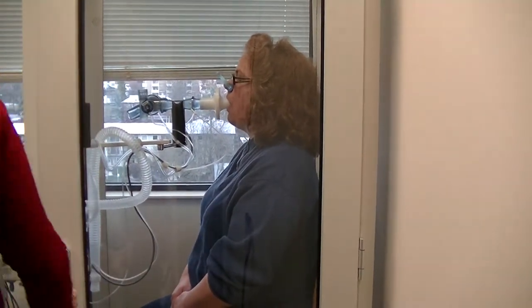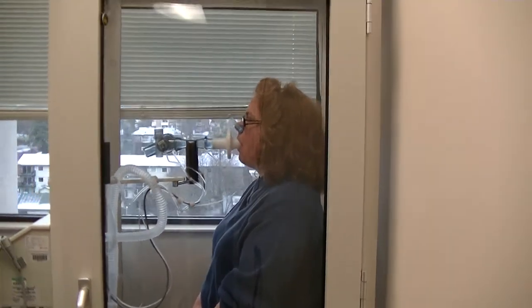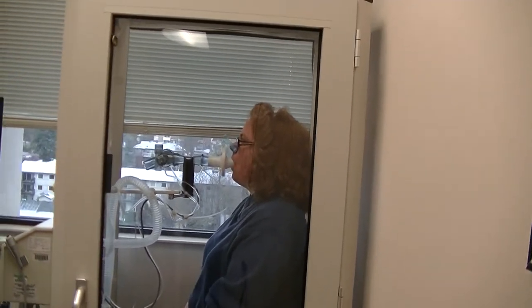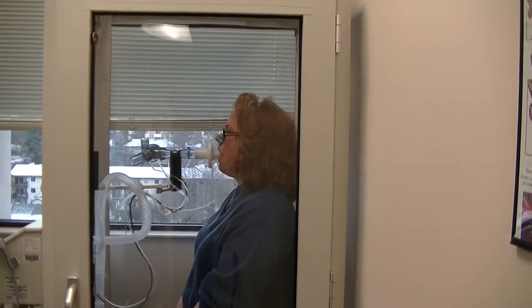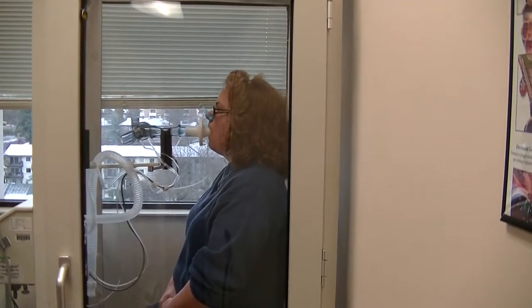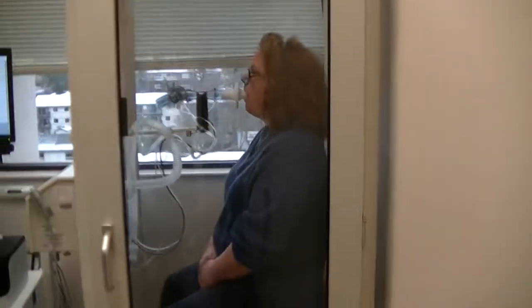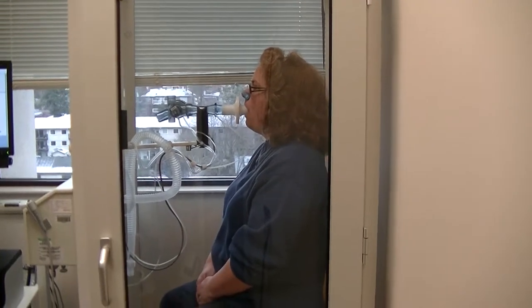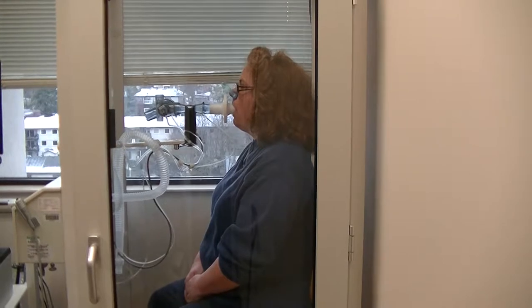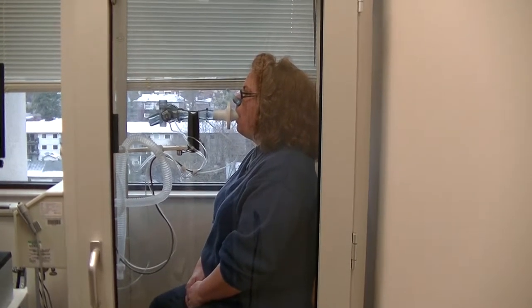And I'm kind of loud. Terrell, can you hear me? Okay. Just regular breathing. Breathe in and out. Perfect. Good job.